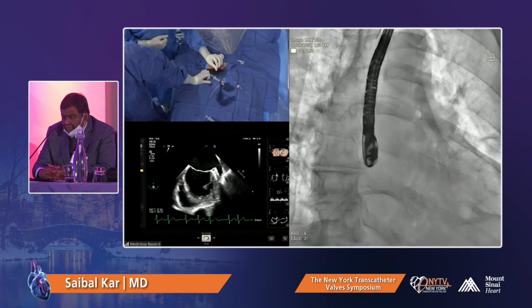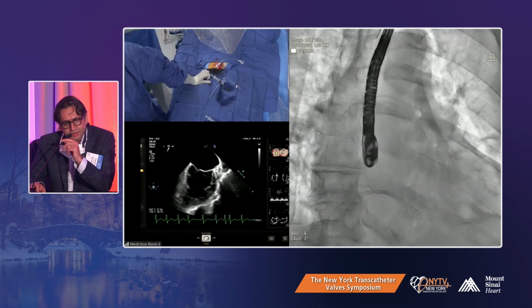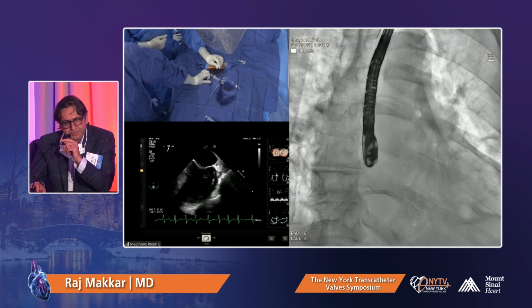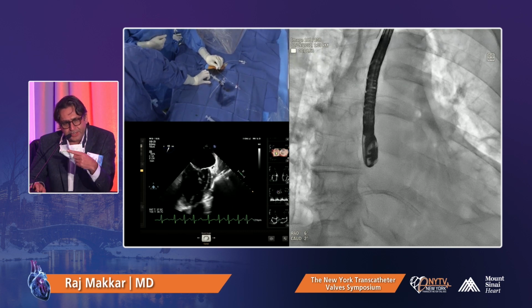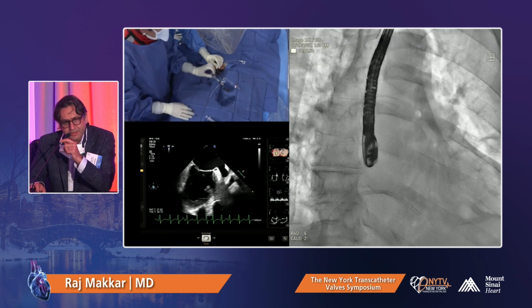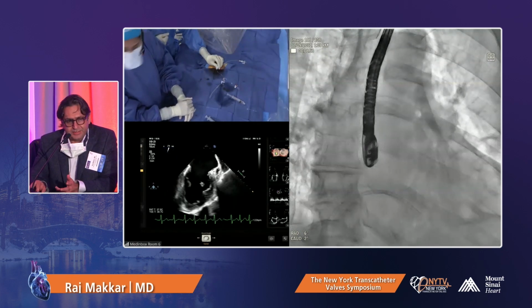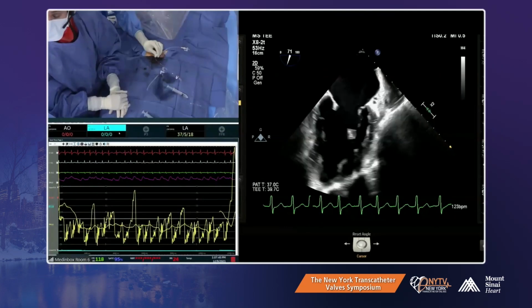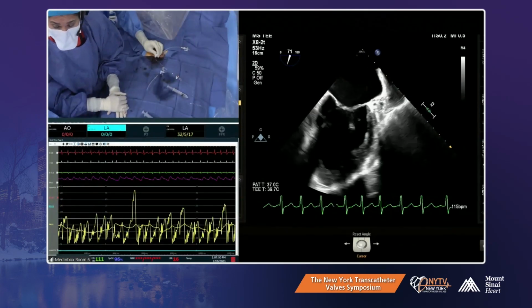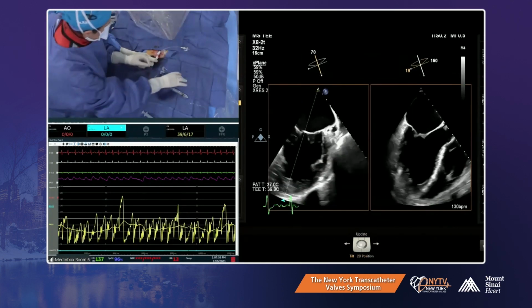Anu and Samin, just to mention, there's another transseptal system called the VersaCross, which is what we are using now. It uses electric energy, but the important thing is that it's got this pre-shaped wire, which is pretty strong, and then you can advance the MitraClip guide over it, so you don't have to do any exchanges. Made by Baylis, now acquired by Boston. That's a radiofrequency wire, correct? Yeah. In a small community hospital, I can't afford the expensive stuff, so I just use the Bovie.